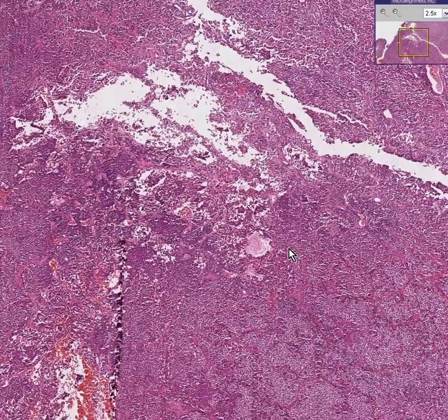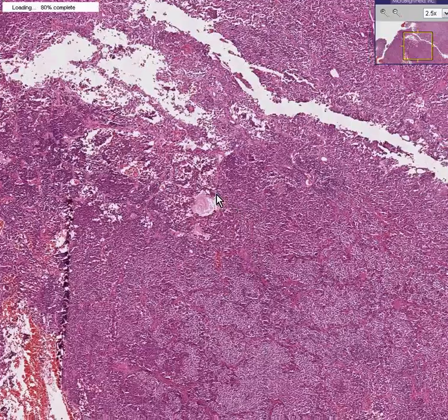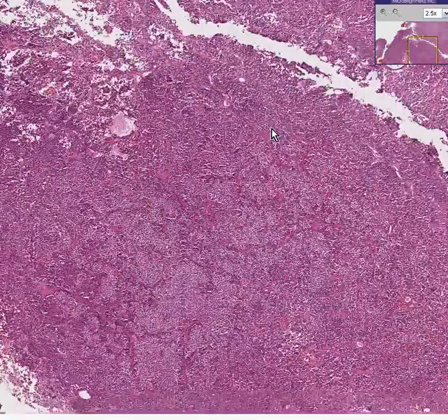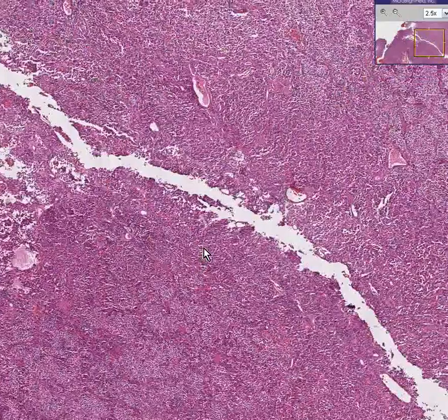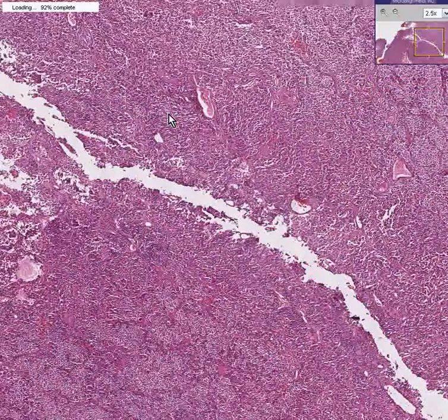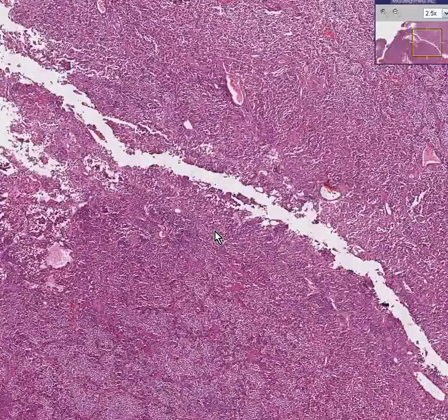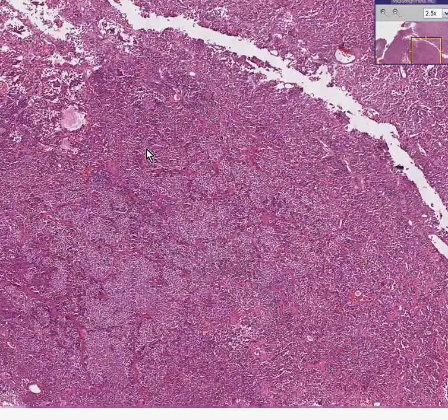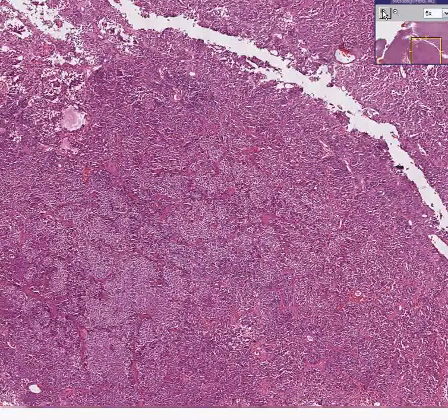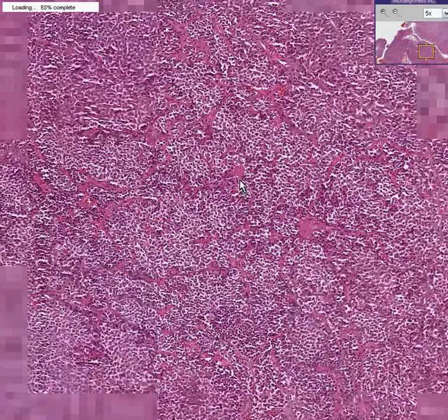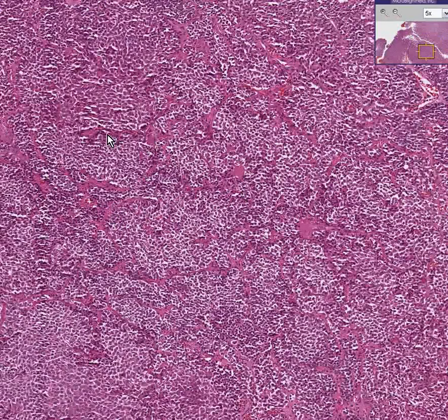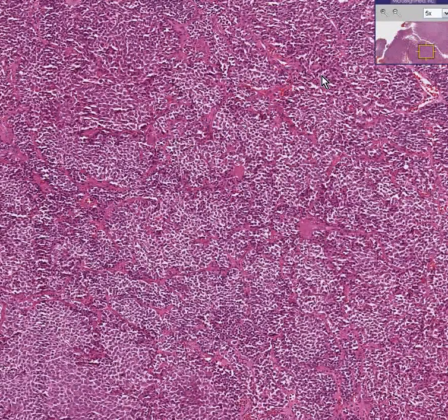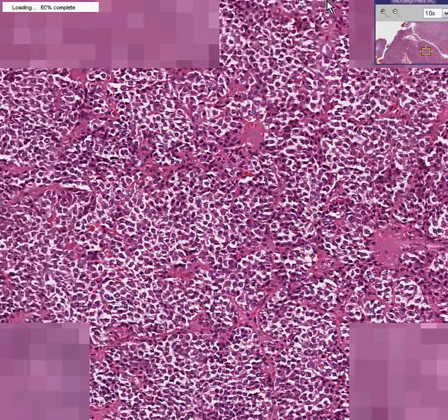Because there are only three kinds of cells in the anterior lobe — the acidophils, the basophils, and the chromophobes — all you have to do is figure out which kind of cell this looks the most like, and you have yourself a diagnosis. This seems to be the general type of pattern in the gland. Notice that all these little septae here are not only fibrous tissue, but they are carrying rich blood vessels to supply all of these cells.